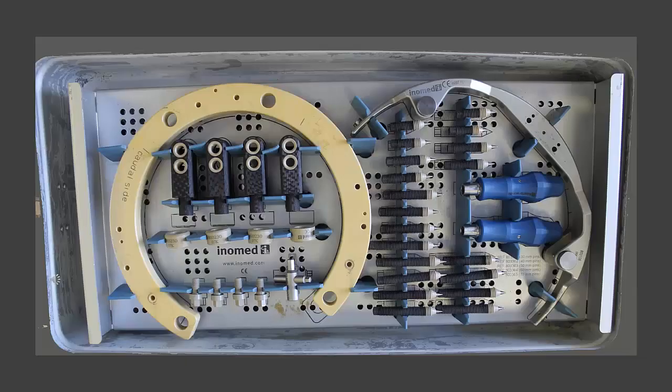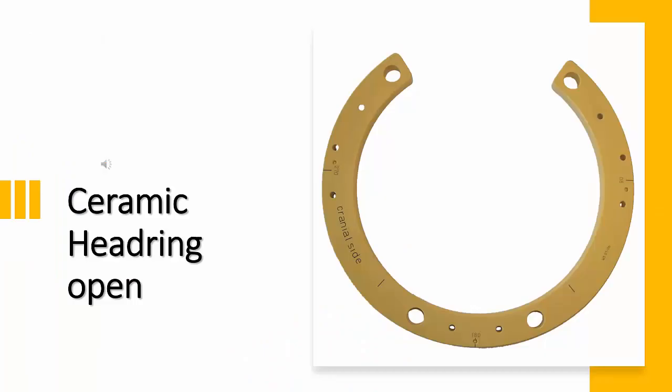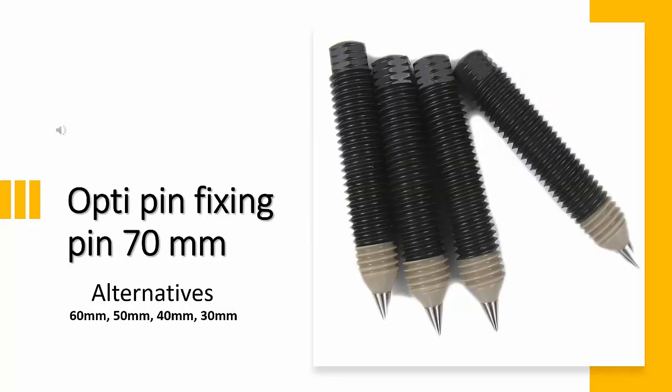The RM stereotactic system basically consists of a headring and an aiming bow unit with instrument carrier. This is the half-open ceramic ring type. The posts used for fixation at the ceramic ring are made of carbon fiber. There are assortments of different lengths of opti-pins: 30, 40, 50, 60, and 70 millimeters.